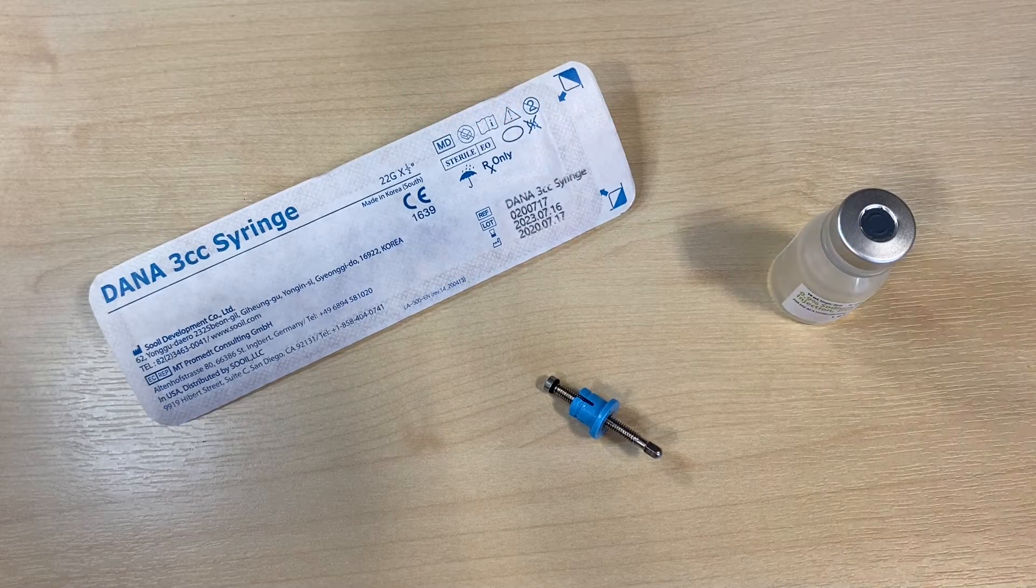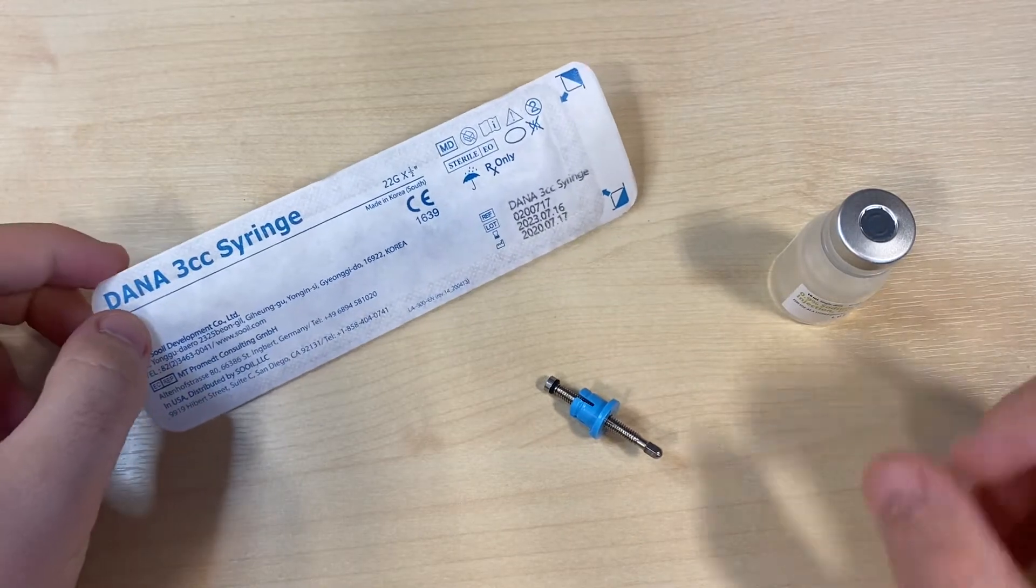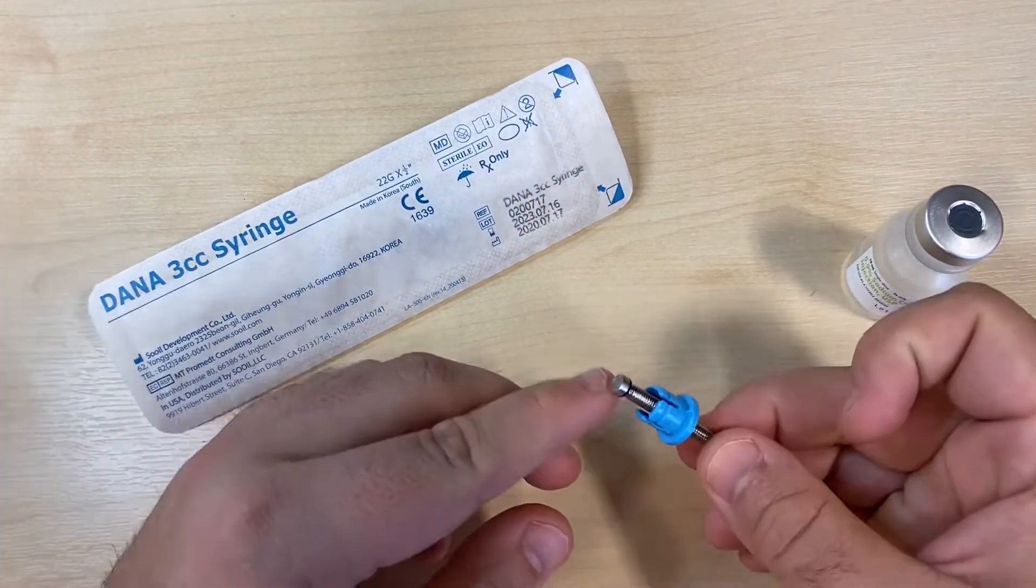Filling a Dana cartridge. You'll need your syringe, some insulin, and your linking screw.